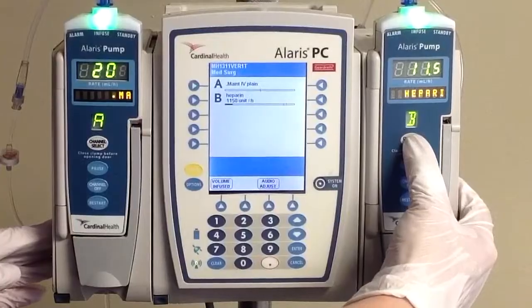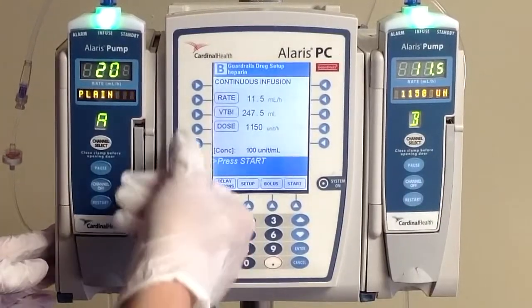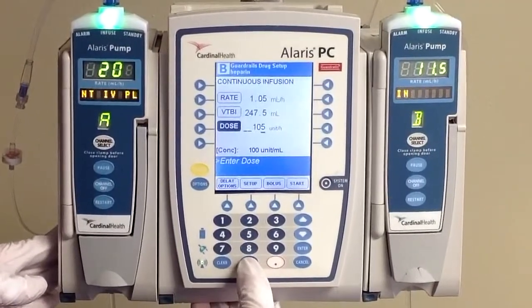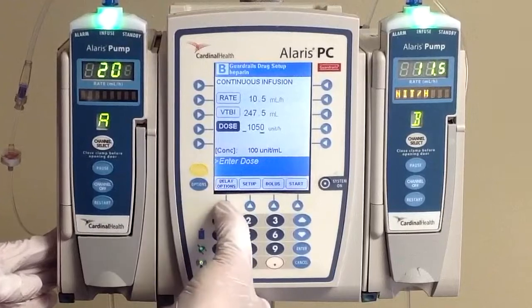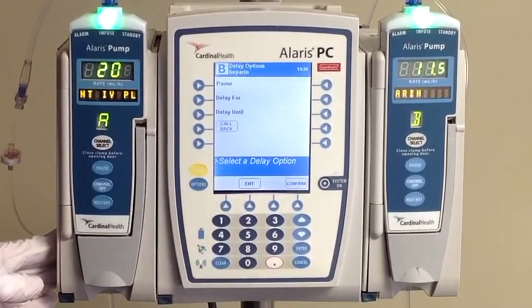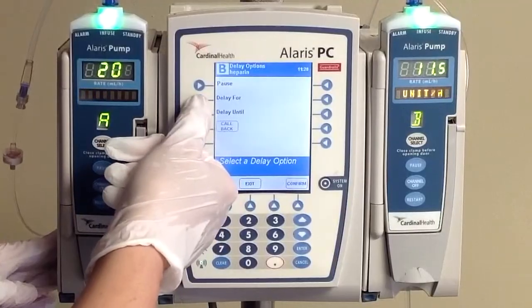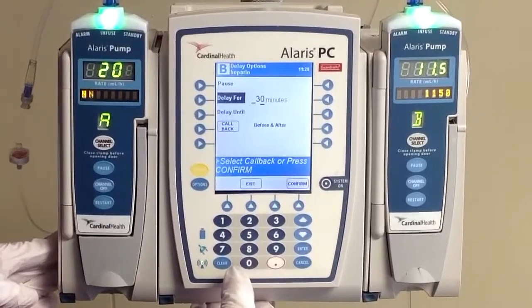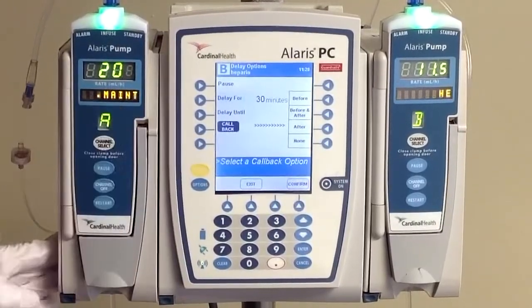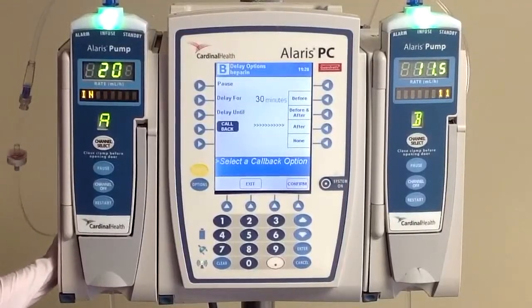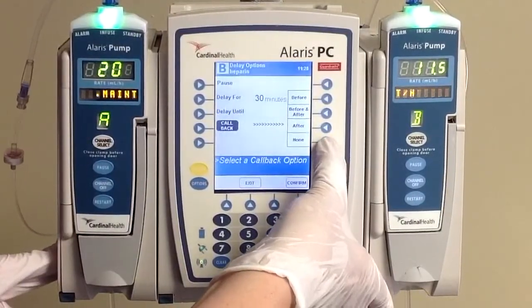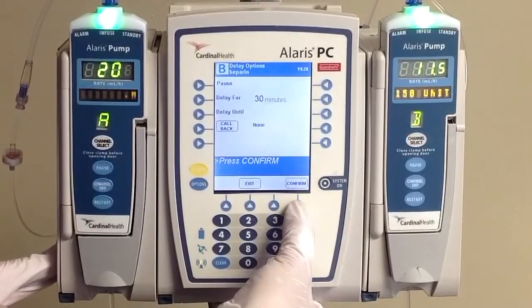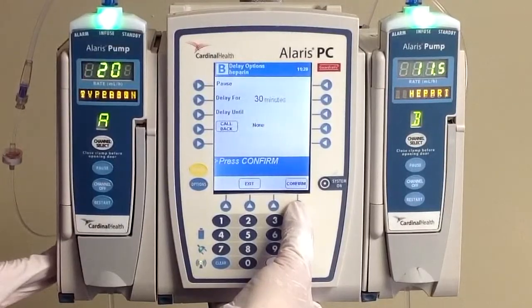Start by doing channel select. You're going to change your dose from 11.50 to 10.50, which will automatically calculate our rate for us. Now we're going to use the delay options button in order to stop our pump for 30 minutes — we're going to use the delay for option within here. Go ahead and type in 30 minutes. And before we leave here, click on your callback options and change this to a no callback option. What that's going to do is, after 30 minutes, our pump will just restart at our new rate of 10.5 mLs per hour, rather than stopping and requiring us to come back in. Go ahead and click confirm.